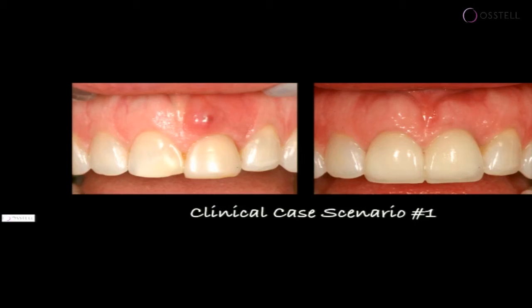Can you go back? I'm sorry. I wanted to comment a little bit about the really nice result that we see here. And I believe that one of the reasons that this was almost invisible dentistry, meaning you can't really tell what was done here, is because as part of the procedure, the original tissue contours were preserved. They weren't recreated by provisional placement or by developing contours, etc. They were preserved in the first place.